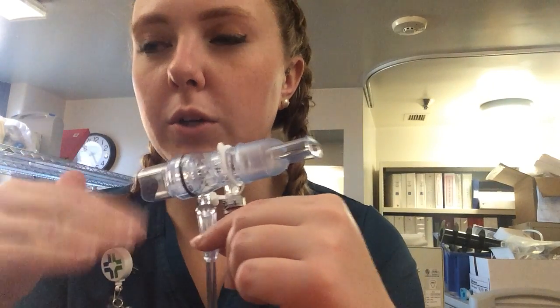I have the tubing hooked up to a flow meter plugged into the wall. I'm going to be running that between 5 and 15 liters per minute, starting at 5, most likely working between about 8 and 10 liters per minute.